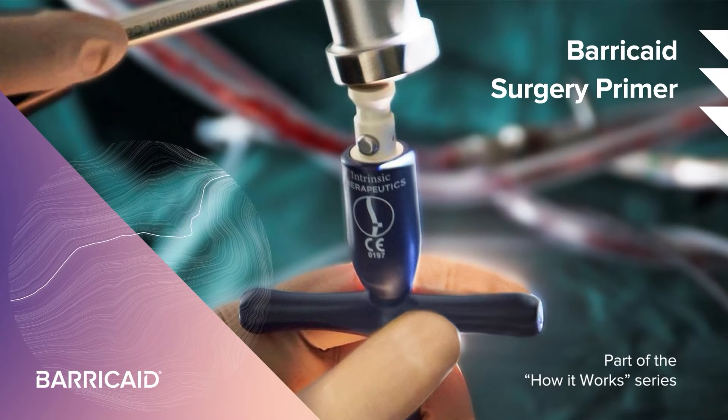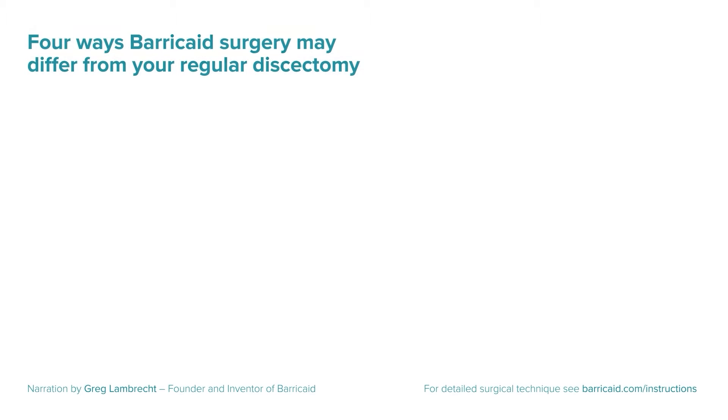This is a five-minute primer to refresh you on the key aspects of the surgical technique for the barricade annular closure device.